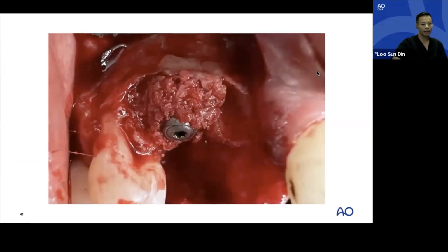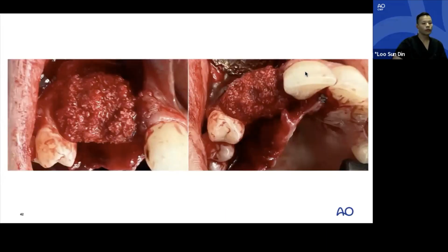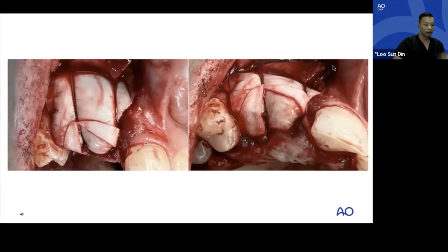First, laminate the peri-implant with pure autogenous bone chips and over-contour the 1-2 and 1-3 with the 50-50 autograft and xenograft, extending both buccally and palatally. You can never have too much. Slap on multiple layers of collagen membrane and suture with periosteal fixation.